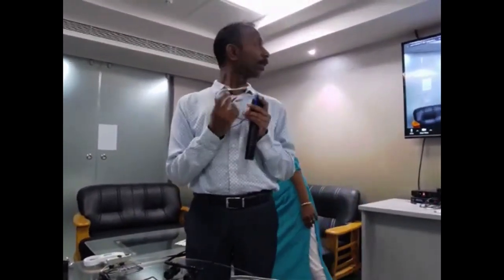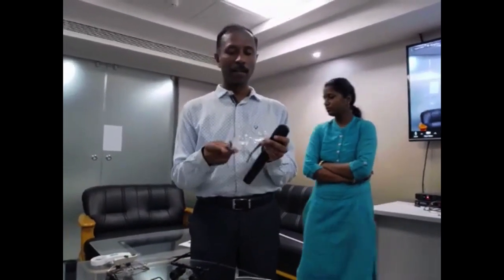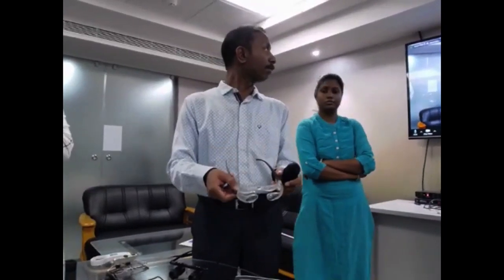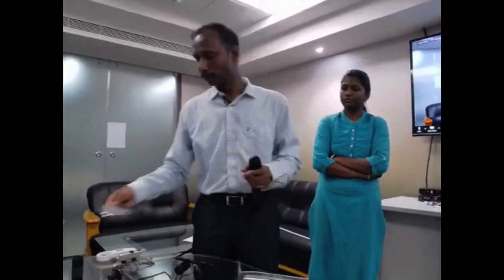This is CTV. Both the objective lenses are attached, so the change in focus happens binocularly. And this is the Max TV, where you can change the focus of each eye at a time. I think this is an overall view of the various objects which we have as low vision aids.